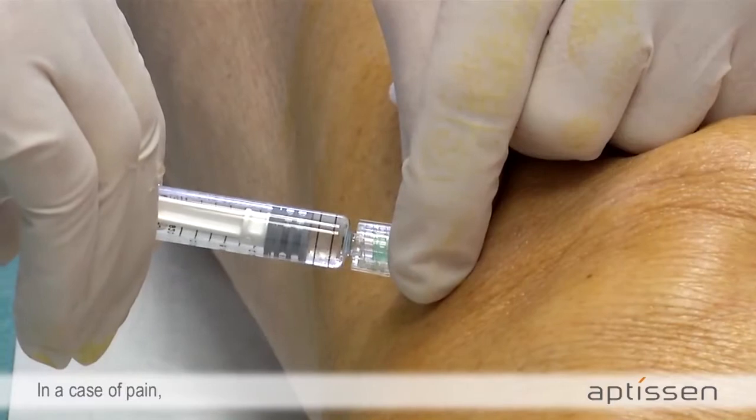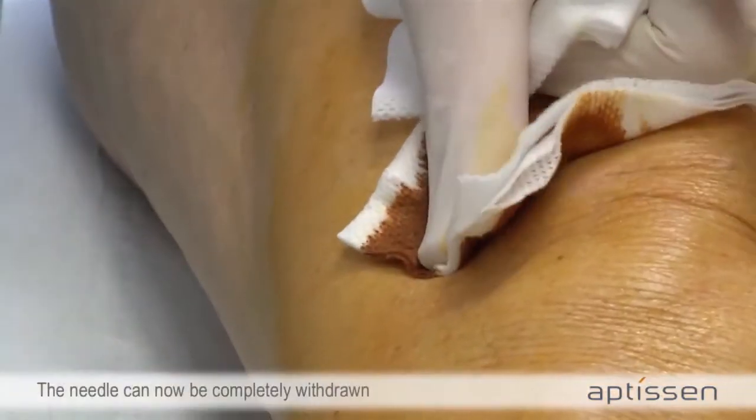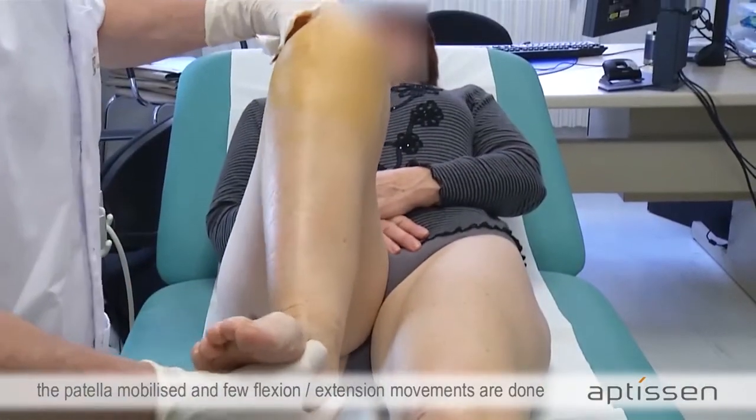In the case of pain, it means that the needle moved out of the intra-articular cavity. The needle can now be completely withdrawn, the patella mobilized, and small flexion and extension movements are done to help the gel diffuse into the joint.